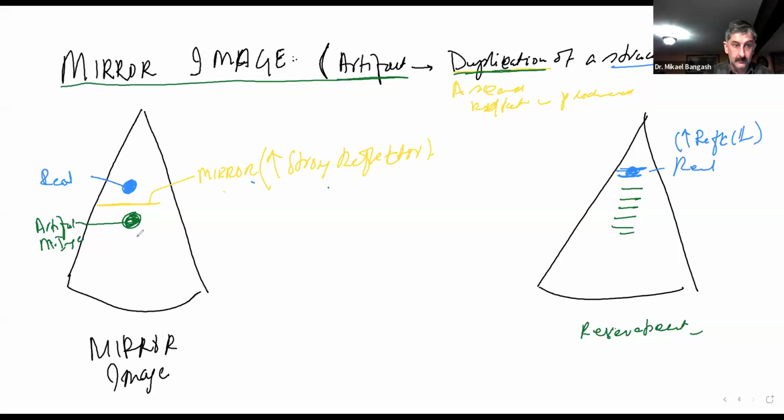Clear? So what we will need to have is a tissue here deeper to your real structure. That is going to act as a mirror, which may mean that it will be a strong reflector. Did you guys get that? Yeah. Good. Now that is just an assumption.